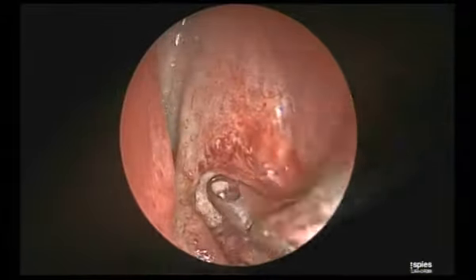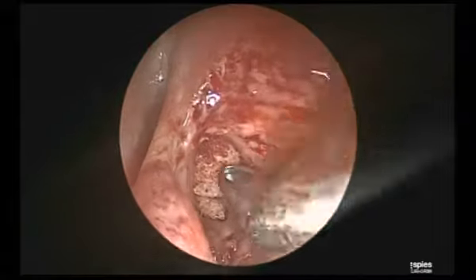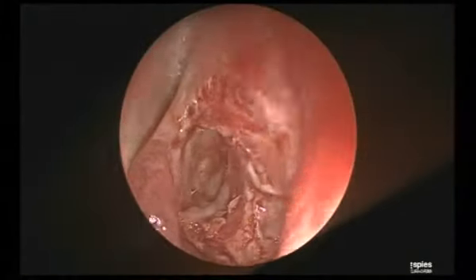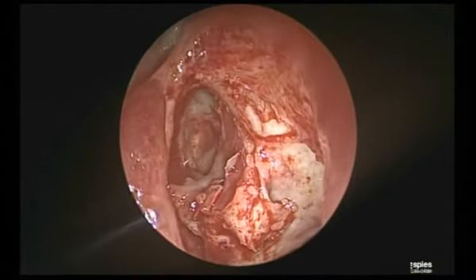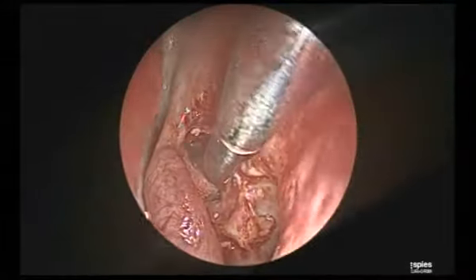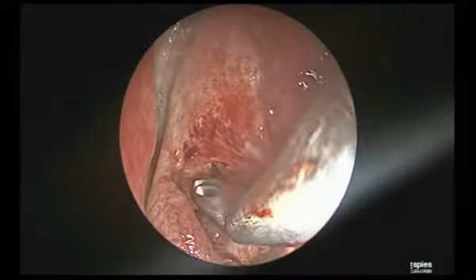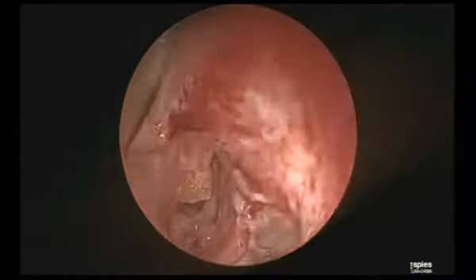No, I think it's perfect. The axillary flap is one thing which I don't do. We don't need to do it. When you're with the 70, you don't need to do it. That is the truth. If something is good, maybe difficult to do, I'll opt for that. I need to have some drive to do that, giving some good additional advantage or outcome. There has to be value addition in doing something. Then everything is secondary to the anatomical structure, and mucosa is secondary.